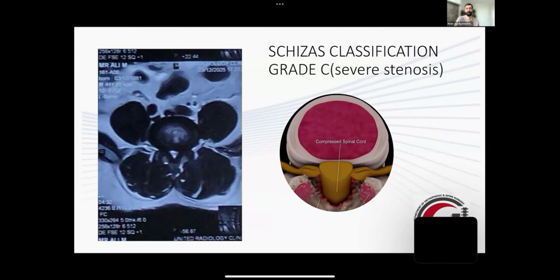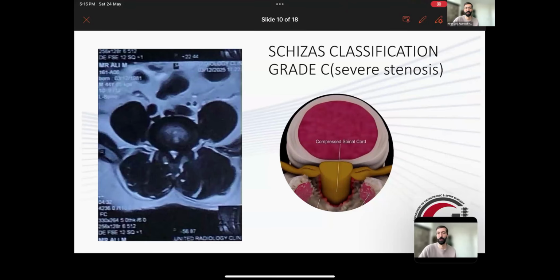That's a great point, Rafael. Just because it's a small incision and a minimally invasive approach doesn't mean you can't do a lot of damage once the instruments are inside. That's a really great teaching point. Dr. Rizwan, since you're at the same hospital as Dr. Khalid here, perhaps you were involved in this case as well. I'm wondering if you have any teaching points from this you'd like to share.